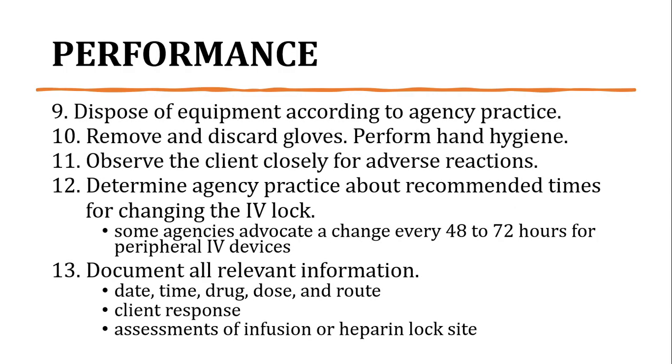Then, dispose of equipment according to agency practice. Remove and discard gloves. Perform hand hygiene. To break the chain of infection, especially in this procedure, there is a chance of blood interaction with the client.